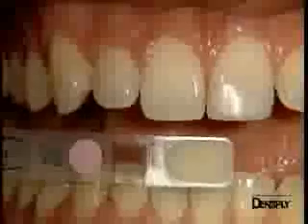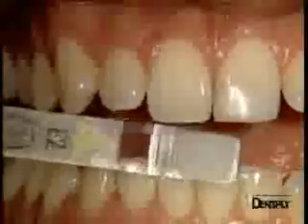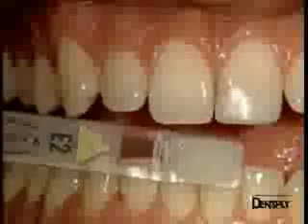For the A2 Vita shade, the recipe indicates a combination of two shades, E2 and D2, i.e. enamel shade number 2 and dentine shade number 2. CeramX Duo will therefore allow us to restore the tooth with two different opacities. The shade guide supplied in the CeramX Duo kit will allow separate evaluation of the saturation levels of shades D2 and E2.